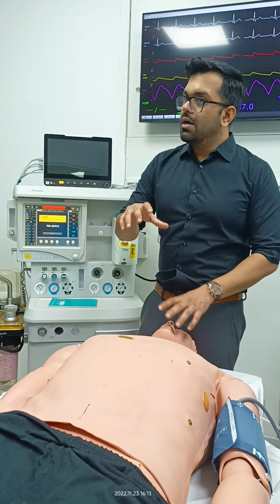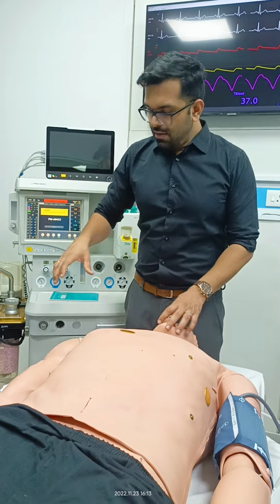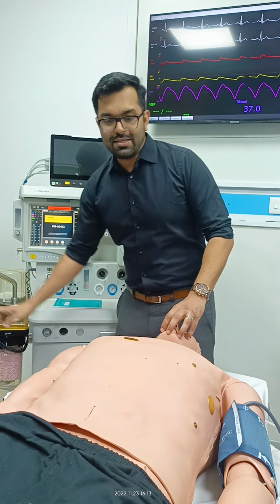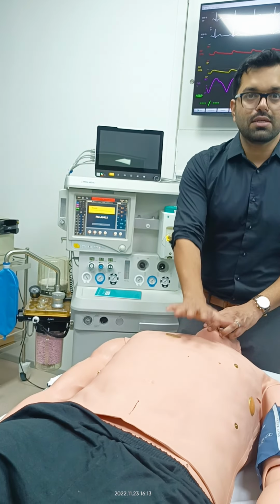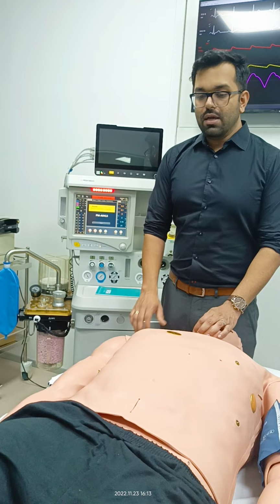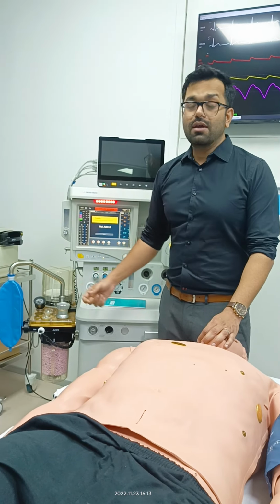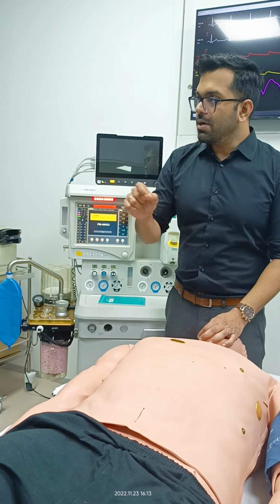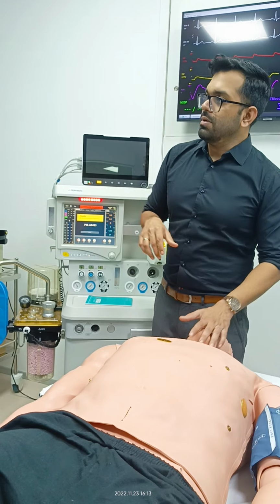After that, we check whether we can ventilate the patient. Do you remember that part? You place the mask, you use the bag and press it and see. When you're pressing the bag, air should go inside the lungs and you should be able to see the chest rise. If there is chest rise, that means I'm able to ventilate the patient. If I give muscle relaxant now, the patient will be completely paralyzed, but I'm confident that I will be able to intubate.